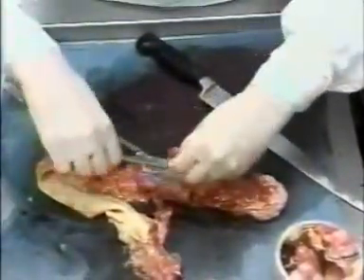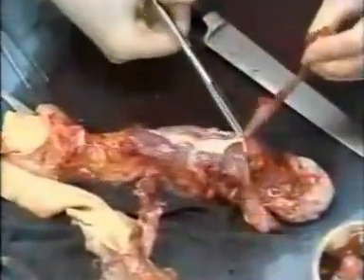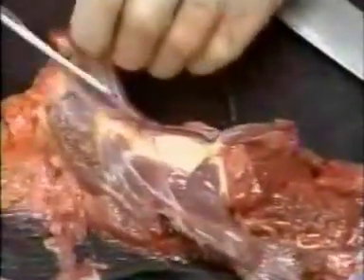Next, you'll dissect down to expose the thyroid gland, which essentially sits like a butterfly with its wings wrapped around either side of the trachea. Thyroid gland. Again, looking like it has normal shape, color, and consistency.